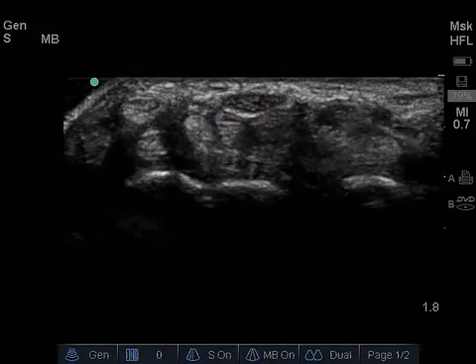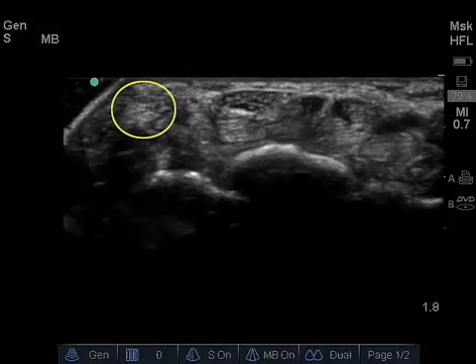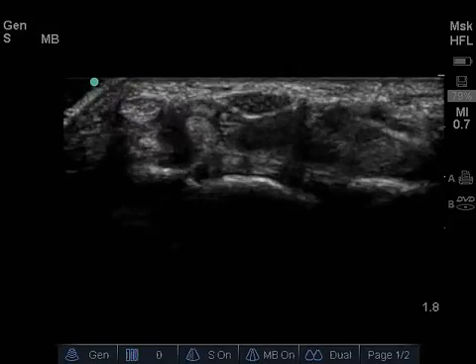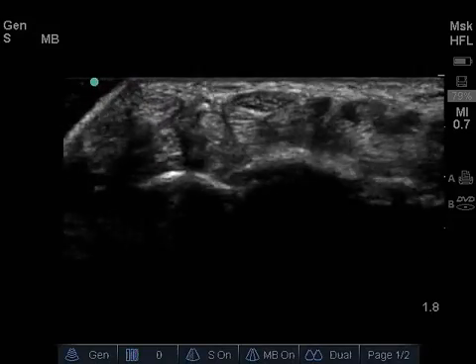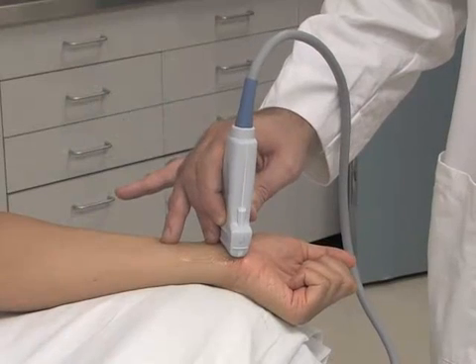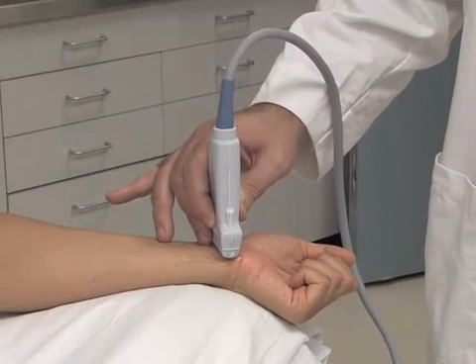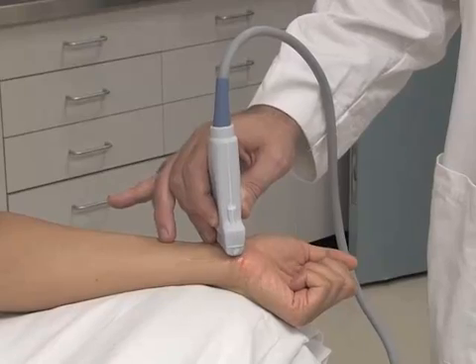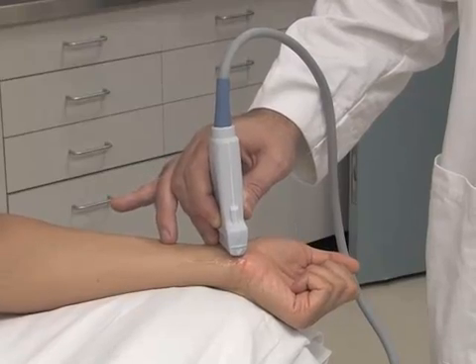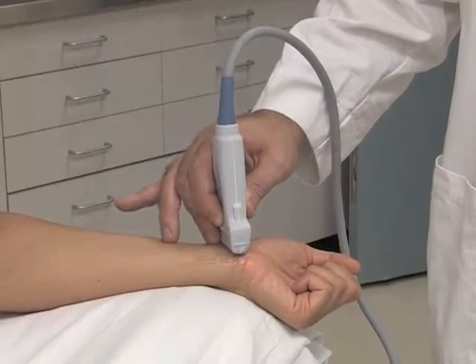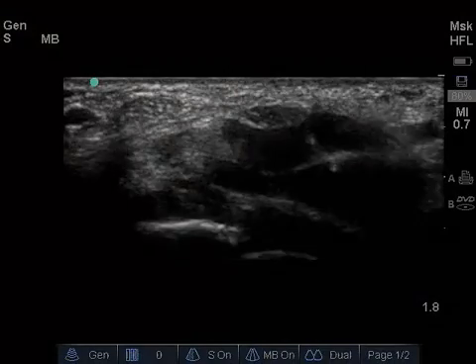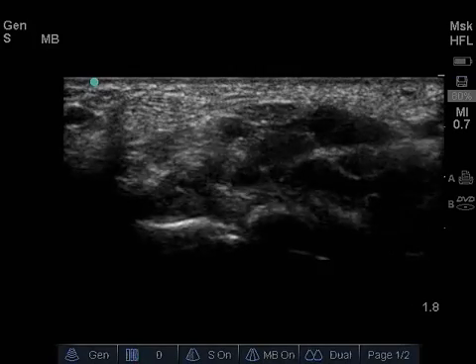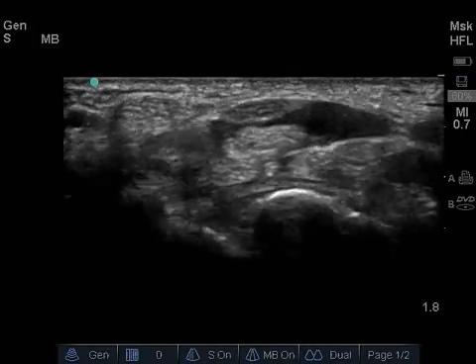Note the flexor carpi radialis tendon radial to the median nerve at the left side of the image. The median nerve can be differentiated from the adjacent flexor tendons by angling the transducer along the long axis of the tendons. This maneuver will cause the tendons to appear relatively hypoechoic due to anisotropy.